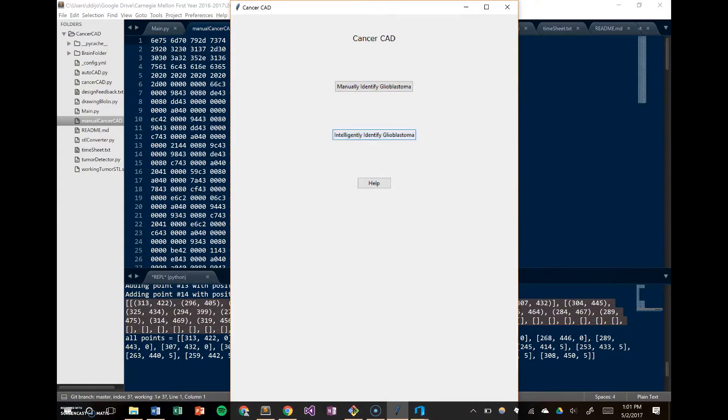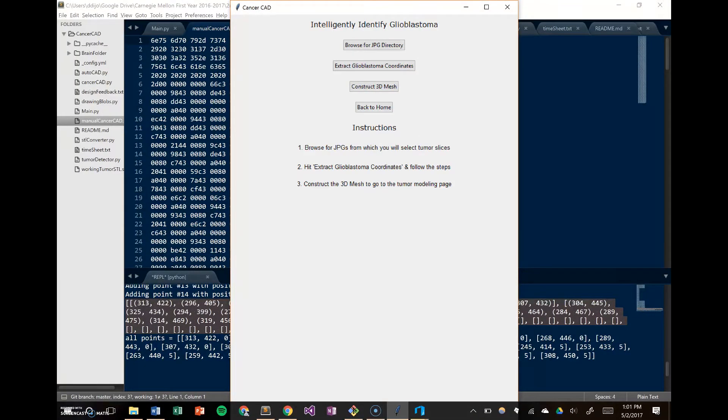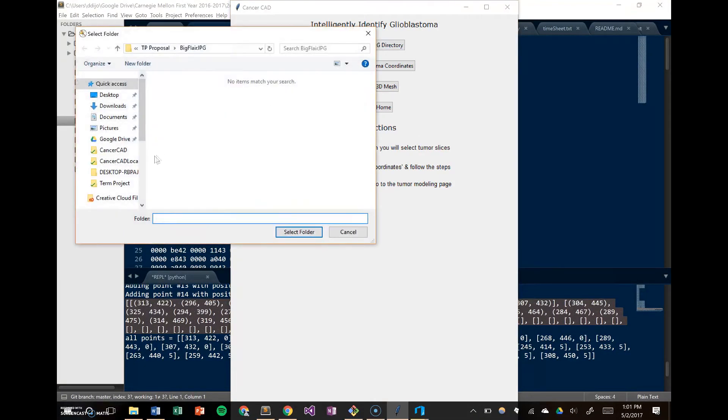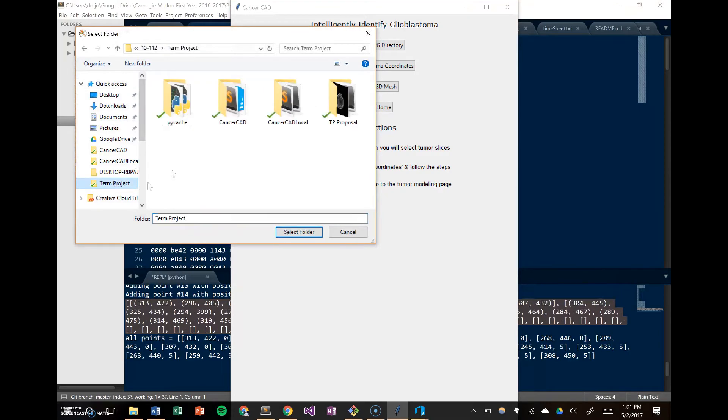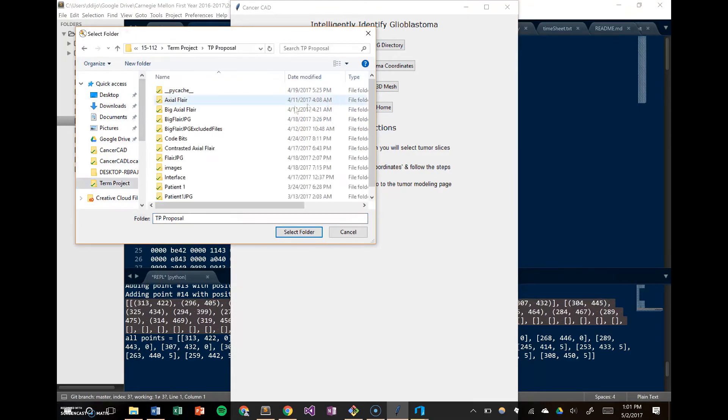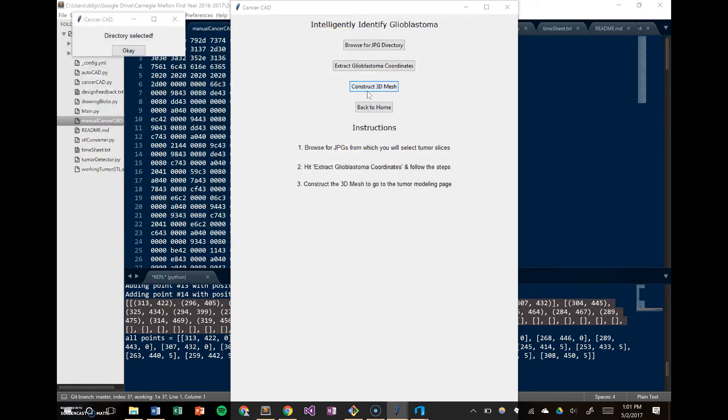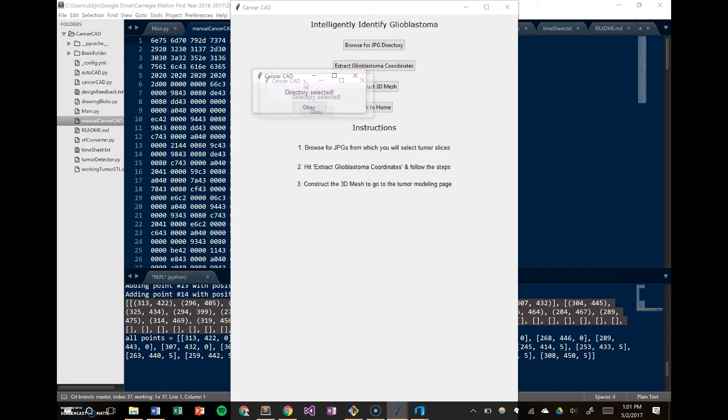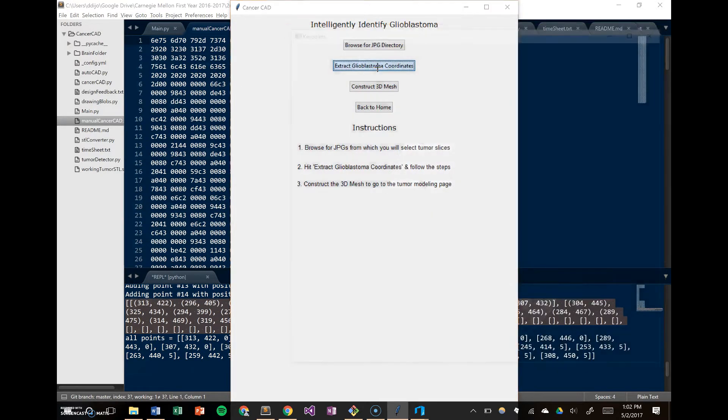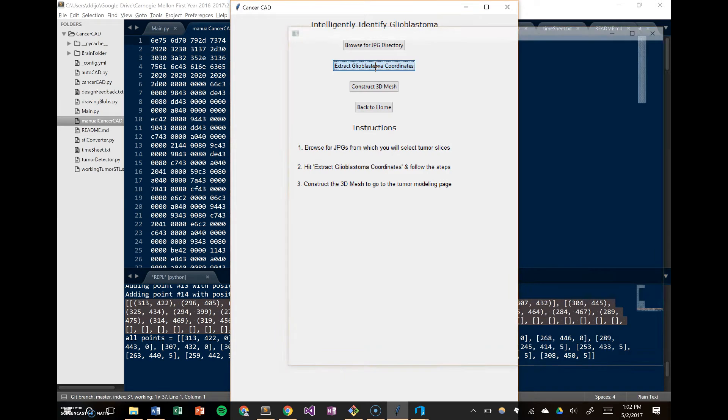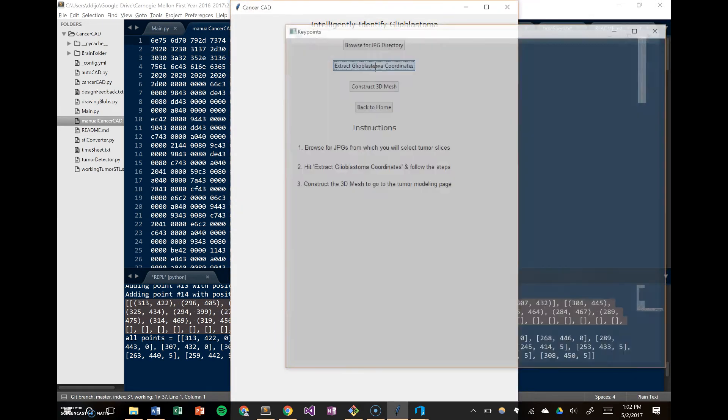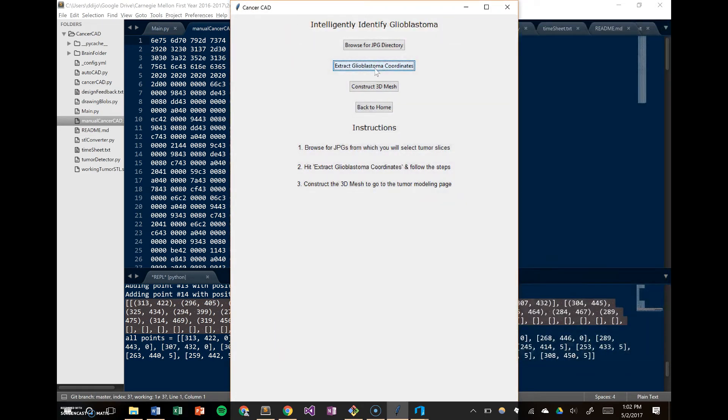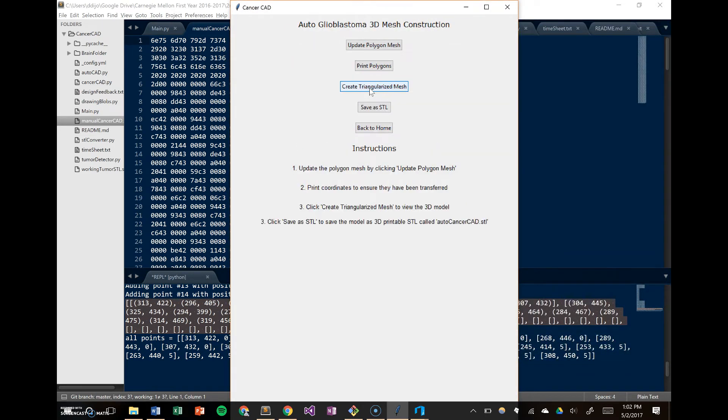So that was the manually constructed 3D object. If we go to the intelligently identified glioblastoma, it's the same process as the manually identified one. Give it the JPEG directory that you'd like. Then it'll intelligently figure out where the blobs are using OpenCV's blob detector, and then it'll extract the coordinates from those blobs and put it into a list. Then you can update the mesh.